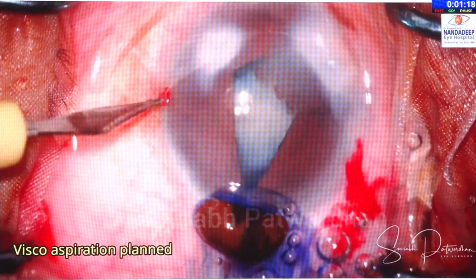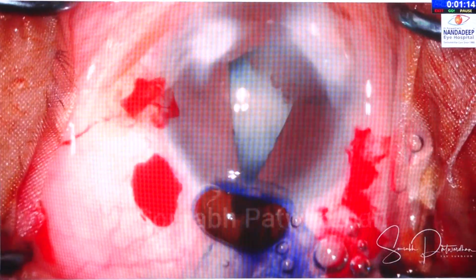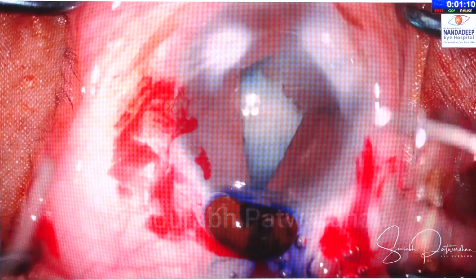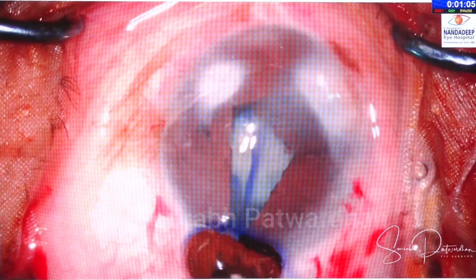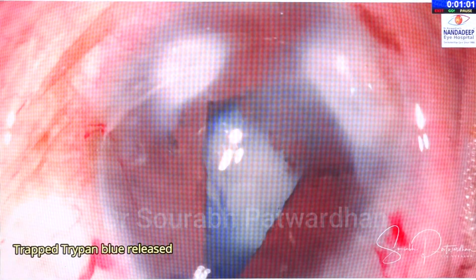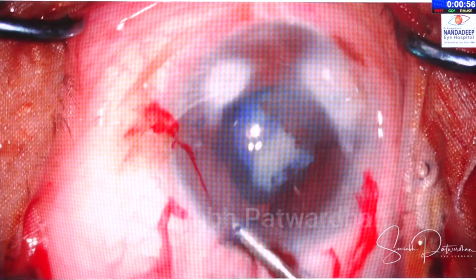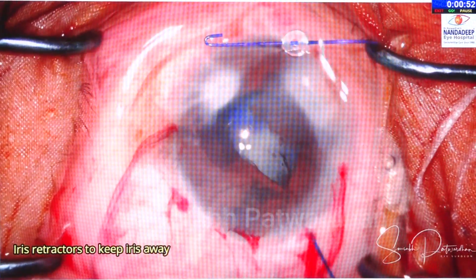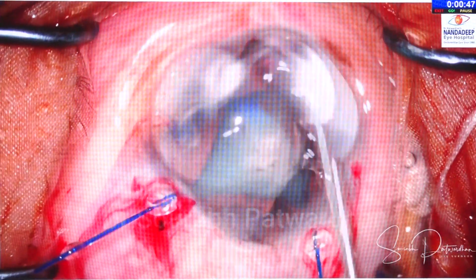So now my plan is to have 2 incisions for bimanual, then another 2 incisions, a little posterior scleral, for putting the iris hooks, because I want to drag this iris back a bit so that I can do the rest of the maneuvers. So now I am going to release the OVD from the anterior chamber, and watch, that was the cause, the trypan blue trapped behind the iris, and once I release that, I could easily put back the iris. If I would have tried 100 times to put that iris back, I would have just damaged the iris and nothing else. Now I use iris retractors to pull the iris back.